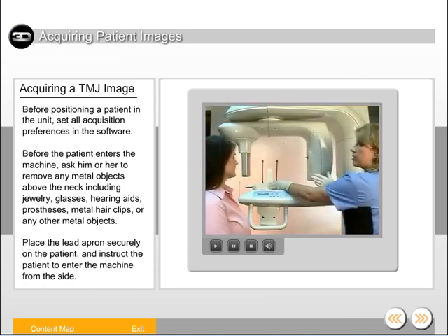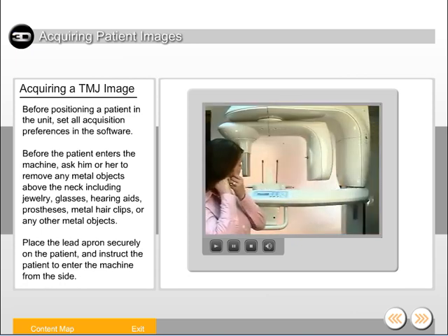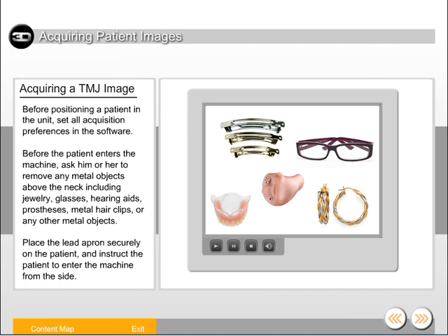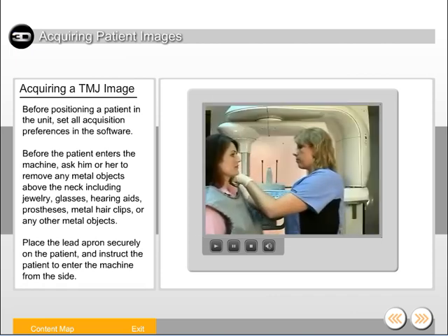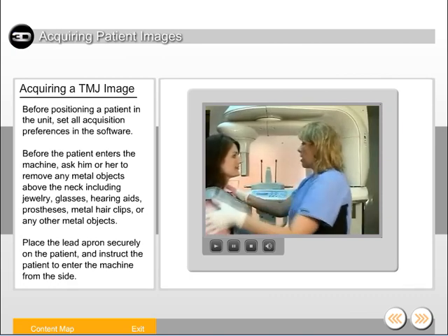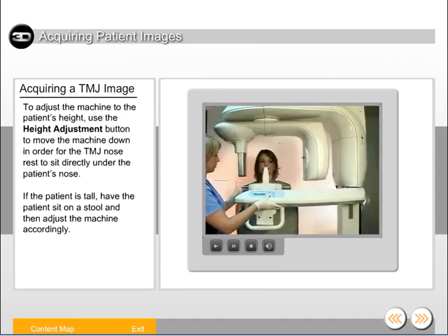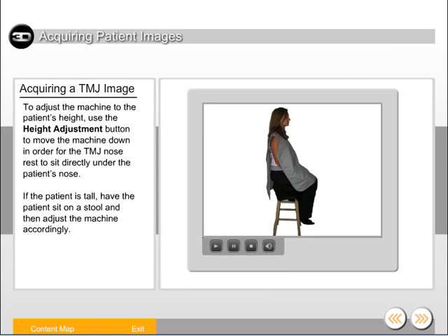Before the patient enters the machine, ask him or her to remove any metal objects above the neck, including jewelry, glasses, hearing aids, prostheses, metal hair clips, or any other metal objects. Place the lead apron securely on the patient and instruct the patient to enter the machine from the side. Use the height adjustment button to move the machine down so the TMJ nose rest sits directly under the patient's nose. If the patient is tall, have the patient sit on a stool and then adjust the machine accordingly.